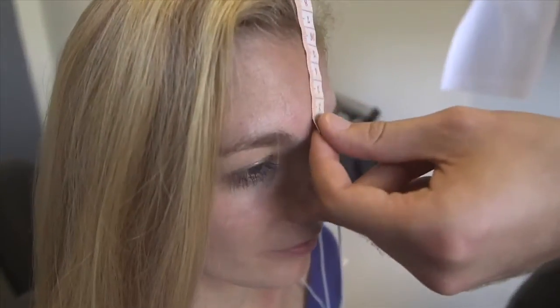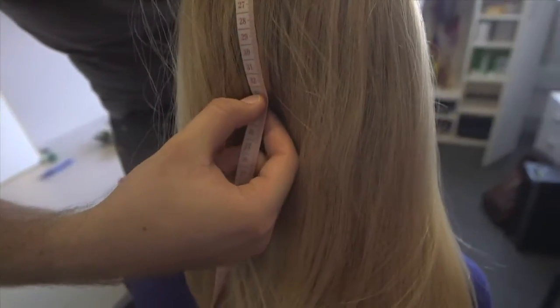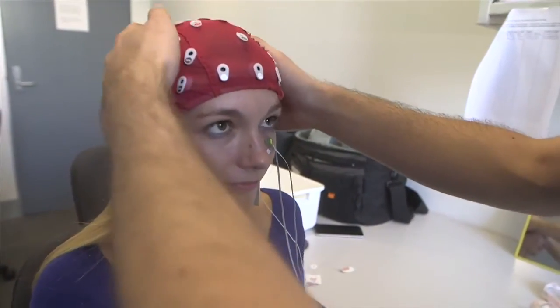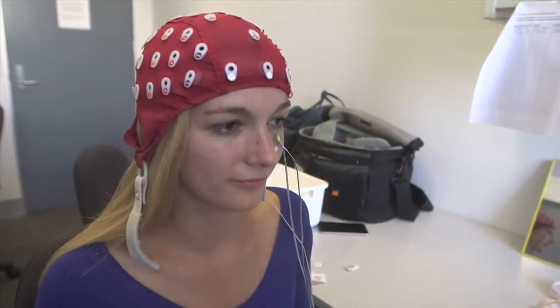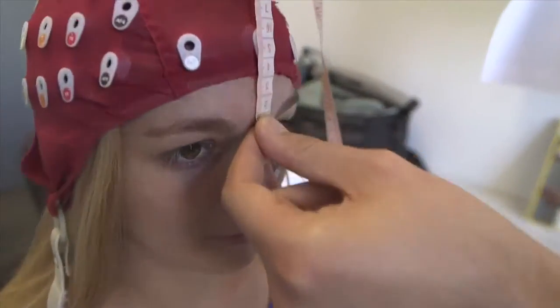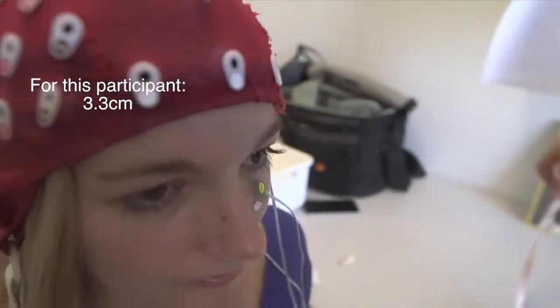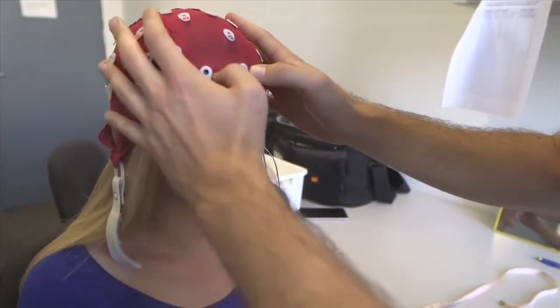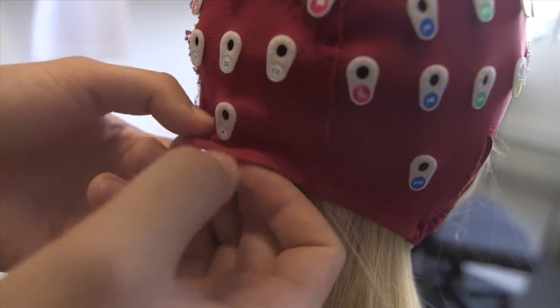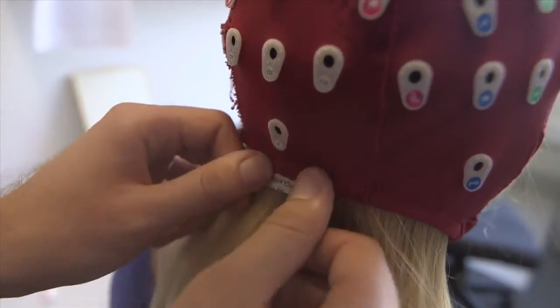Now that you've put on the external electrodes, there's just one more thing to do before putting on the electrode cap. Measure from in between the participant's eyebrows to the back of the head. This will help you when positioning the cap. Once the participant is wearing the cap, make sure that it is on as straight as possible. Then, measure the distance between the middle of the eyebrows and the edge of the cap. In this case, it should be 3.3 centimeters, one tenth of the previous measurement. And don't forget to untuck this poorly placed label so that it doesn't get in the way of the IZ channel.